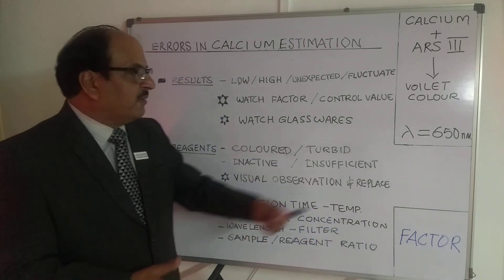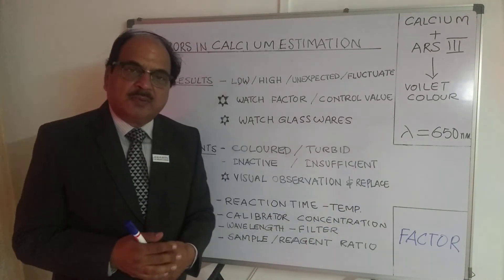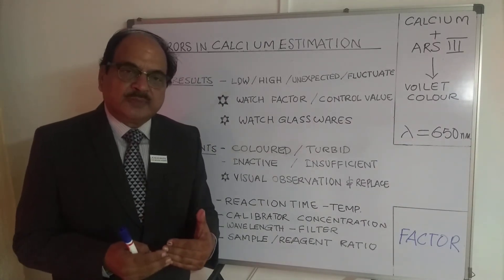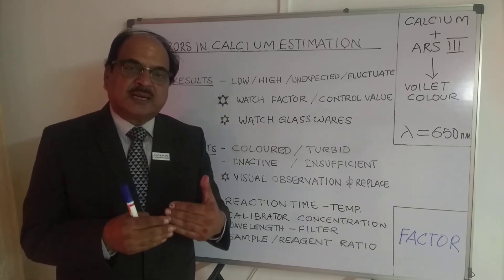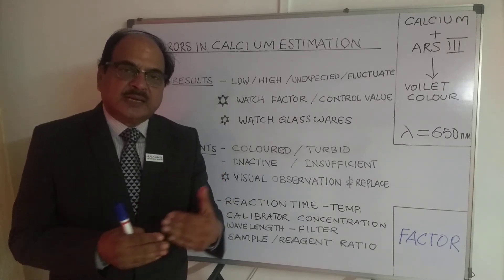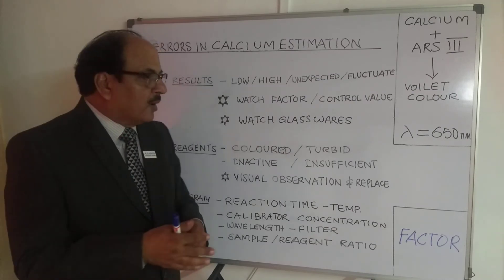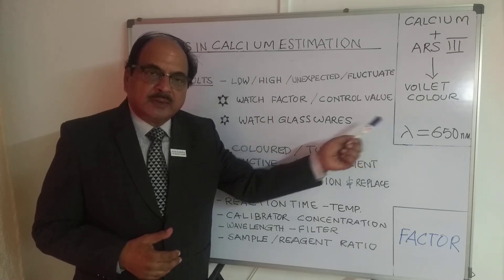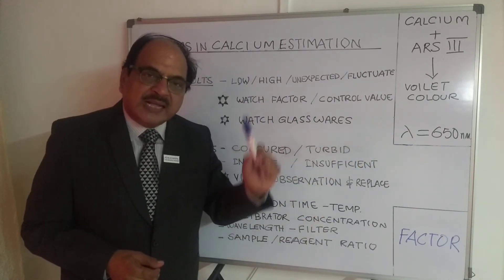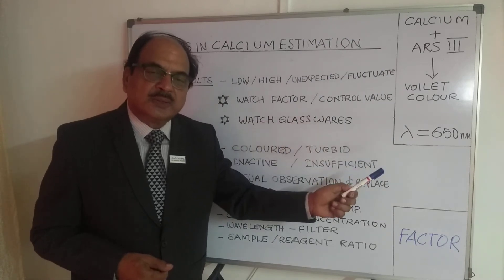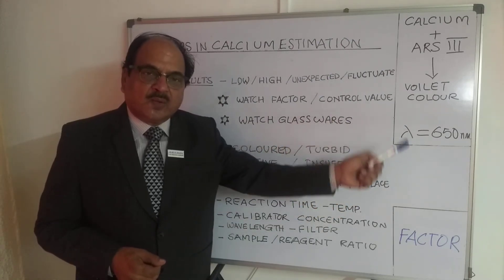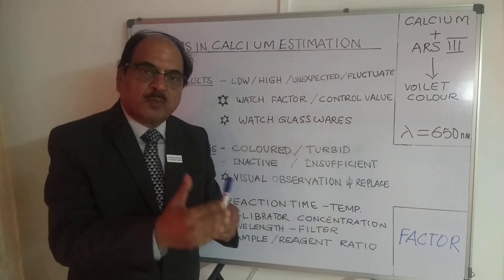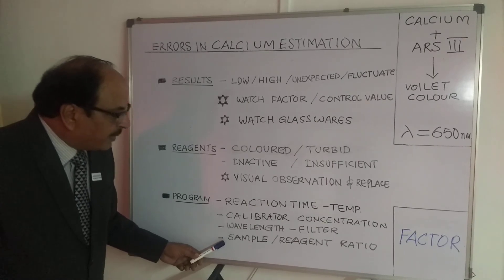Wavelength or filter selection is the next important issue. The recommended wavelength is 650 nanometers, but many analyzers do not have 650 nm available — some have 600, 610, 620, or 630 nm depending on the analyzer manufacturer. Any of these wavelengths above 600 nm is acceptable, but the key rule is that calibration and sample runs must be done on the same wavelength. If that is ensured, your factor will be consistent and results will be accurate.